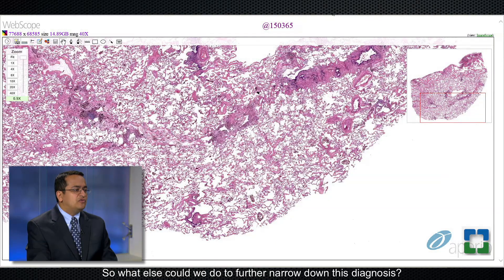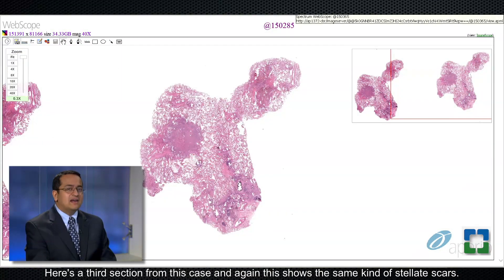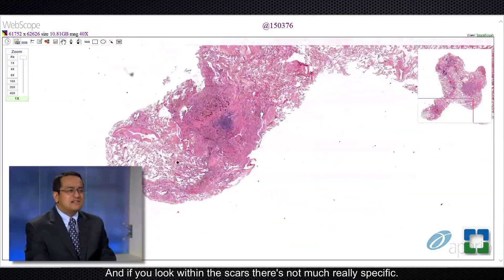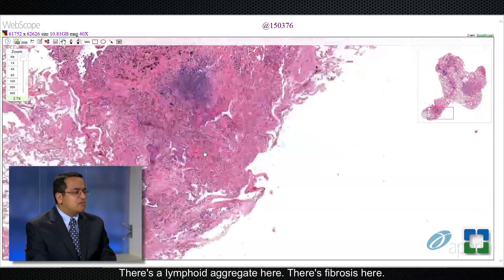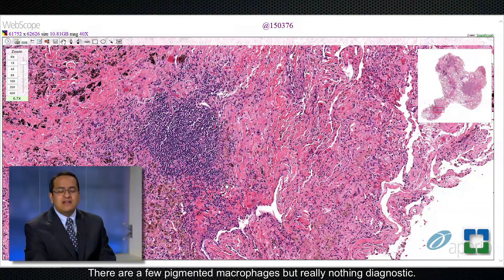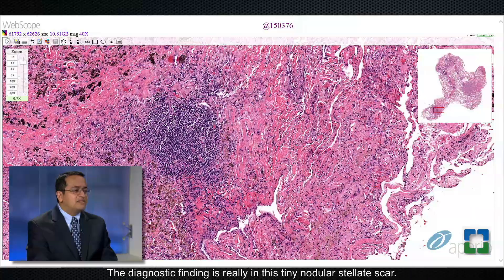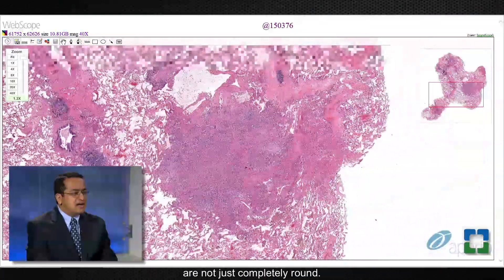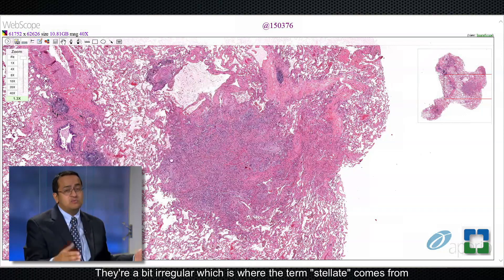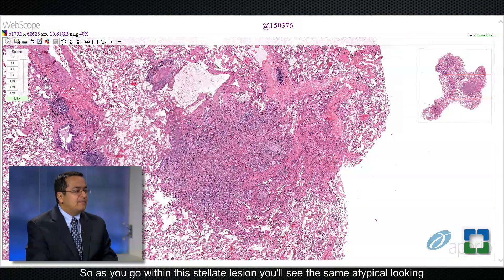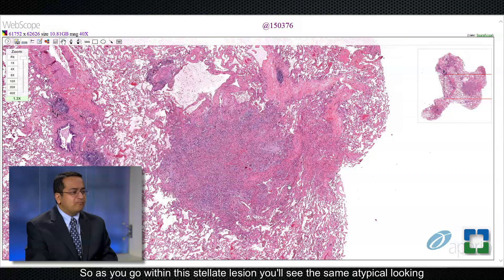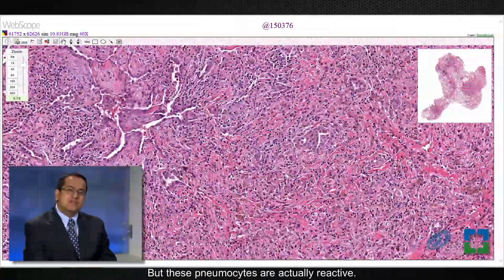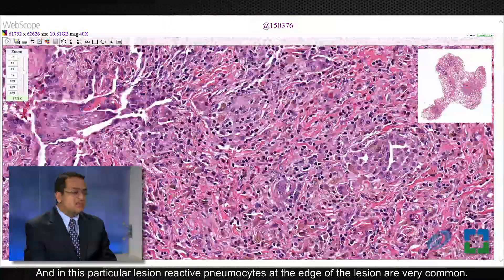A third section from this case again shows the same kind of stellate scars. Within the scars there's not much really specific — a lymphoid aggregate, fibrosis, a few pigmented macrophages, but nothing diagnostic. The diagnostic finding is really in this tiny nodular stellate scar — a lesion distorting the architecture with edges that are a bit irregular, which is where the term stellate or scar-like comes from. Within this stellate lesion you see atypical-looking pneumocytes at the edge, but these pneumocytes are actually reactive, and reactive pneumocytes at the edge of the lesion are very common in this particular lesion.